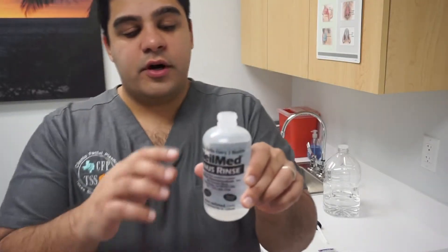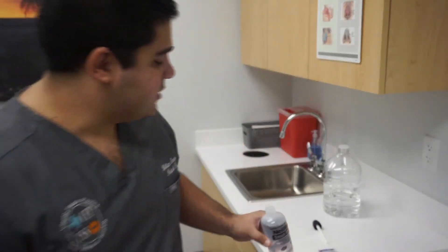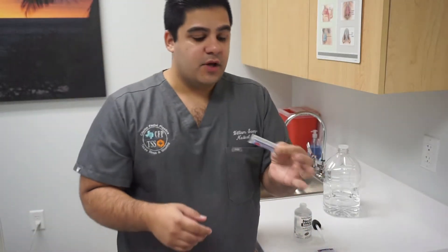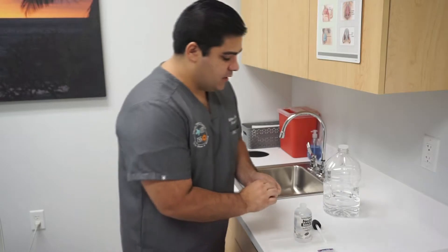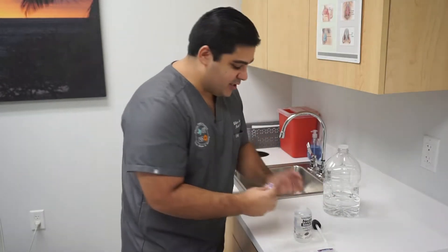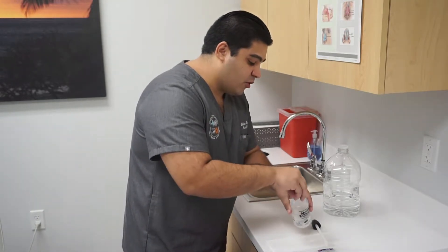Once you have poured water up to that fill line, you want to pour one of these little packets that come with the NeilMed into the bottle. Don't forget to put it in, or otherwise you are not going to have a very pleasant experience and your nose will burn.